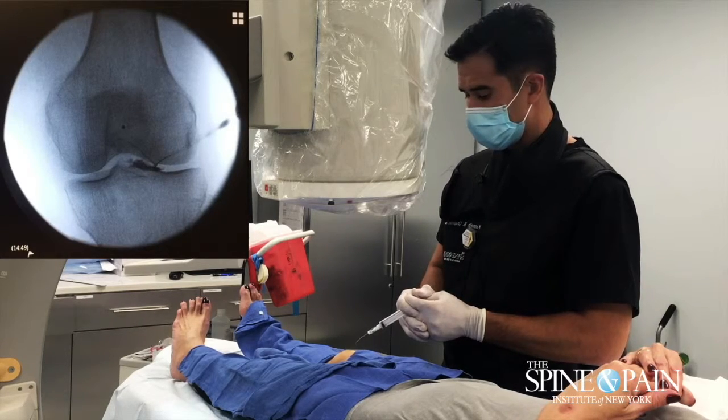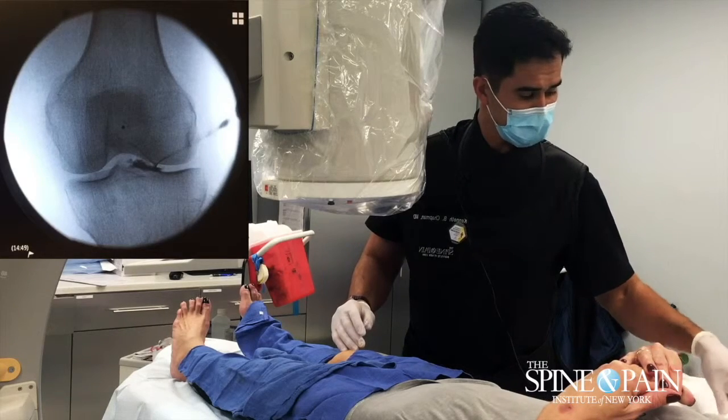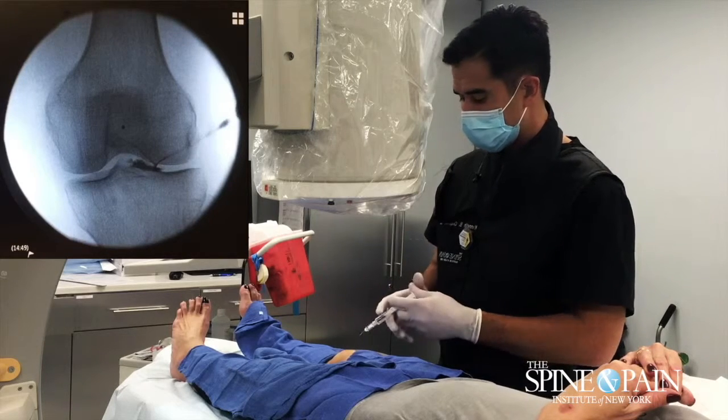You know, this can be done blind as well. Although, in situations like this, it really allows us to see and know for sure that this medicine is getting in there.